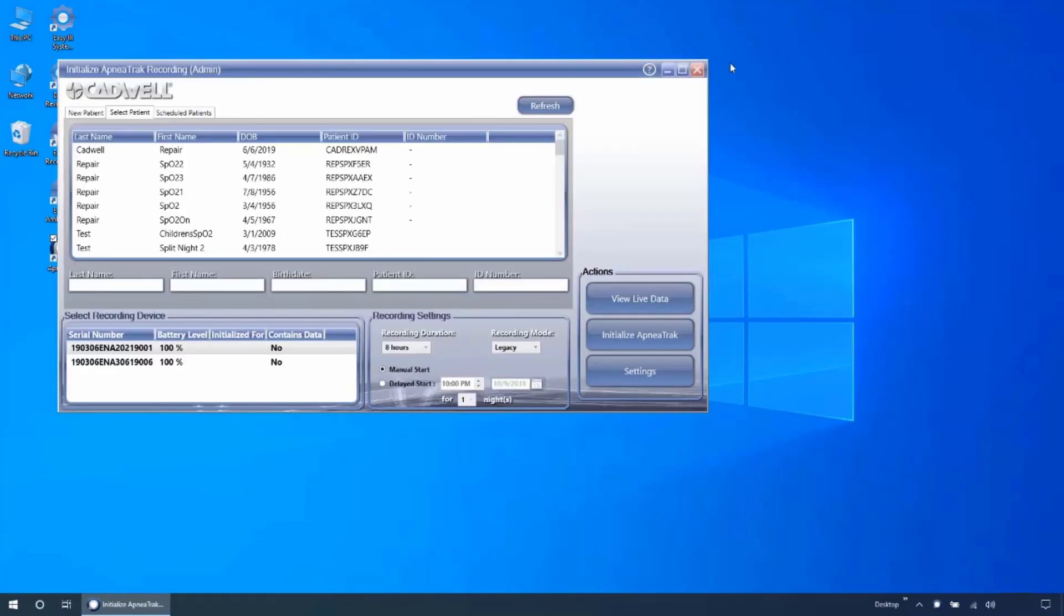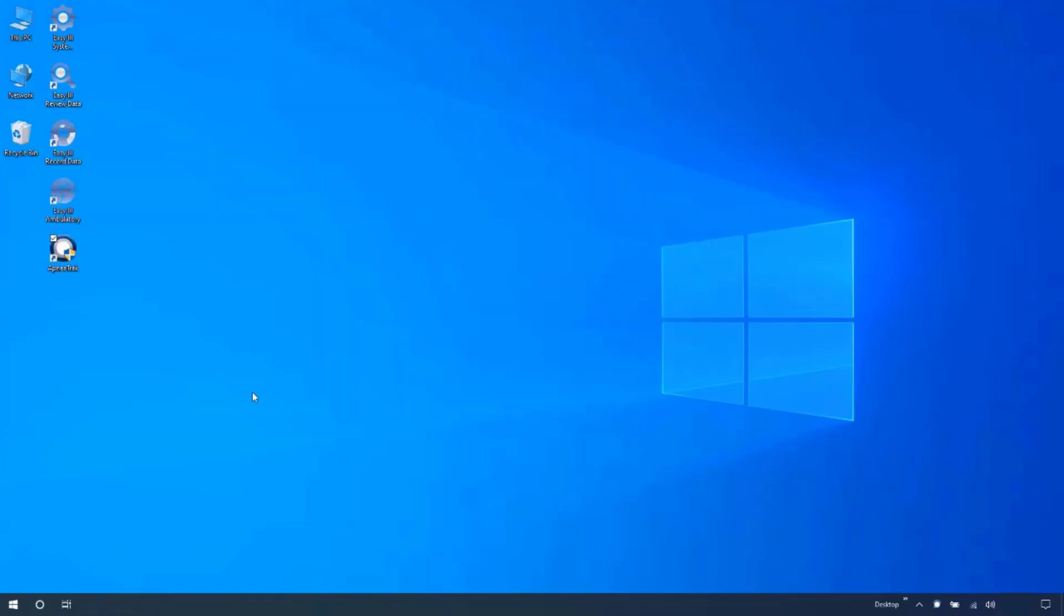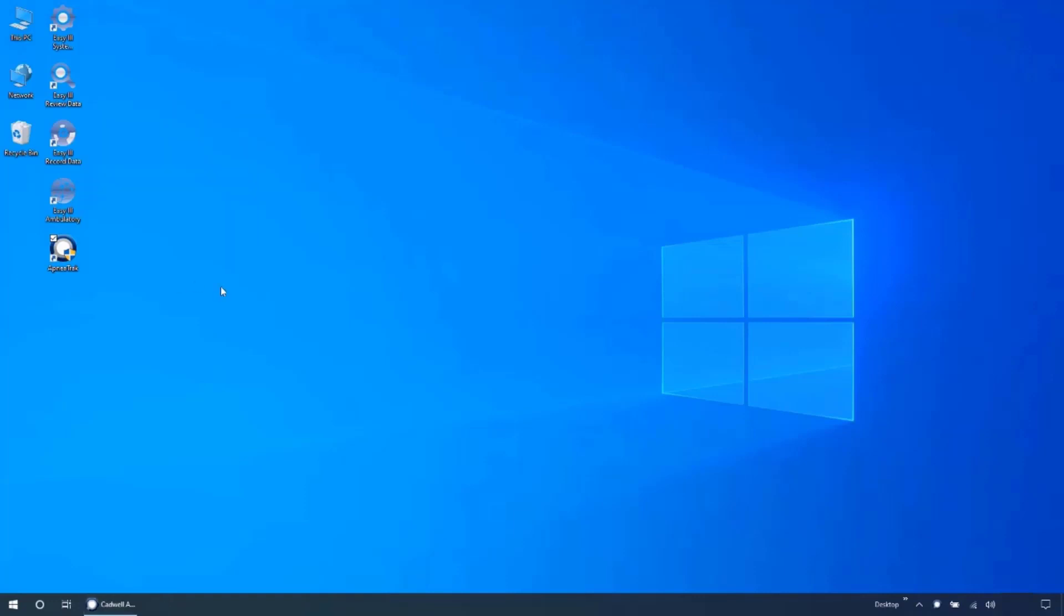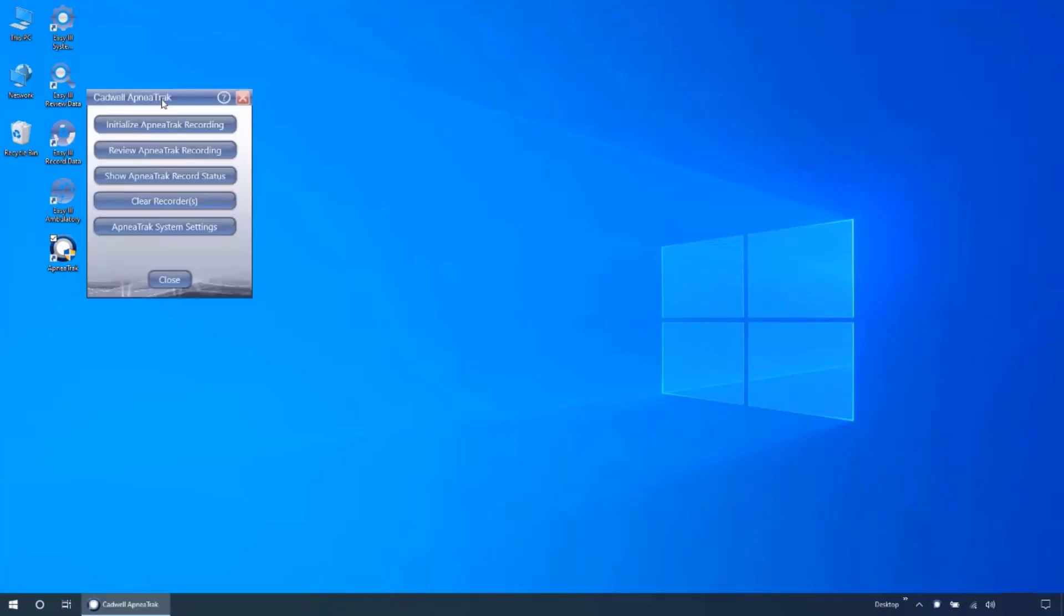If the device has data, the ApneaTrak status window will open. To open the application when the device has already been connected to the computer, you can double click the ApneaTrak icon on your desktop or double click the ApneaTrak icon in your system tray.